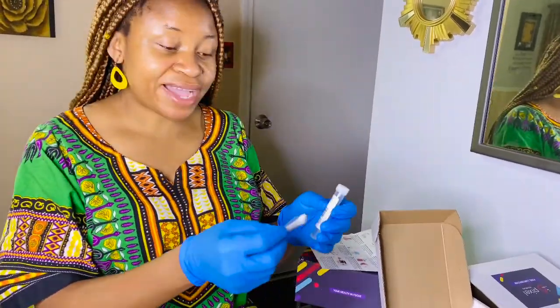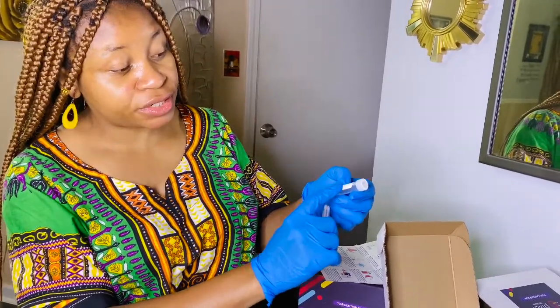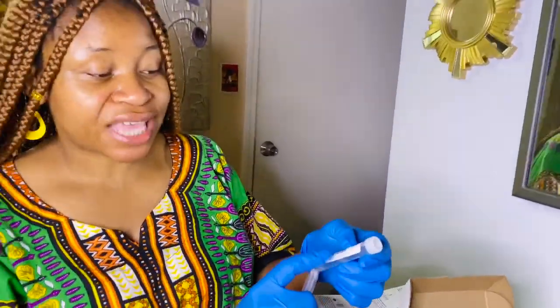All right, we're about to start, guys. And also don't forget to register online using this digit code. I already took a picture of this. After my collection, I'm gonna go on the Pixel Labcorp website, and then I'm gonna register this number. That's the only way your test is gonna get done, if you register the kit. So let's start the collection process.